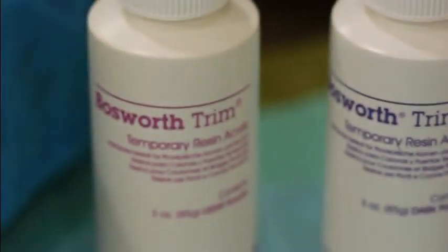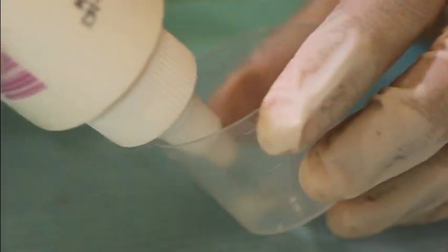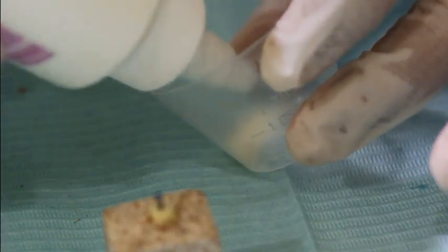For this exercise, we are going to use Trim. Make sure you take just enough monomer to fabricate one temporary crown. Put your powder until it's fully saturated.